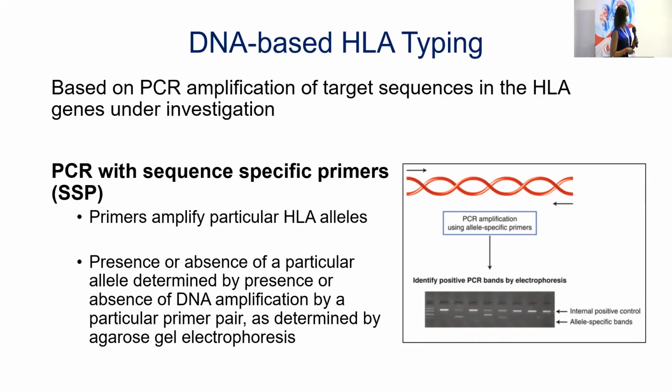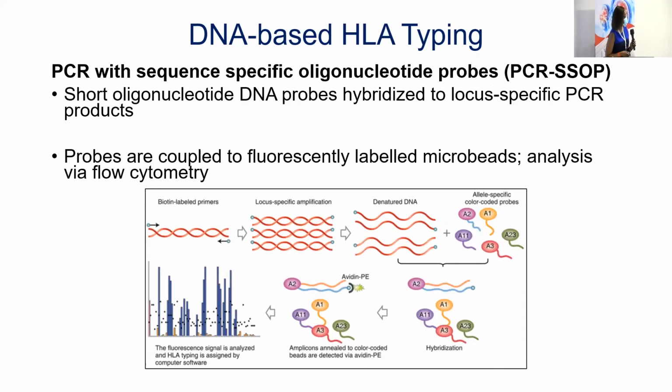They would use the primers to amplify targeted HLA alleles in the recipient and the donor DNA, and then detect for amplification. This is the testing method that is being used at Muhimbili for their solid organ transplant program. For us in Kenya, we want to use the sequence-specific oligonucleotide probes. The principle is almost the same, it's just the methodology that is slightly different.